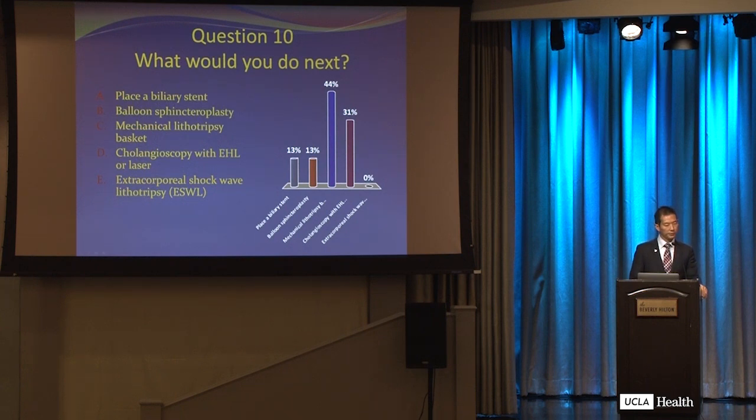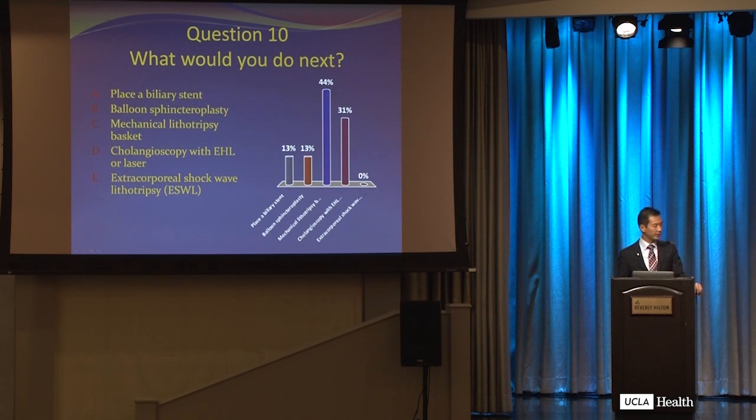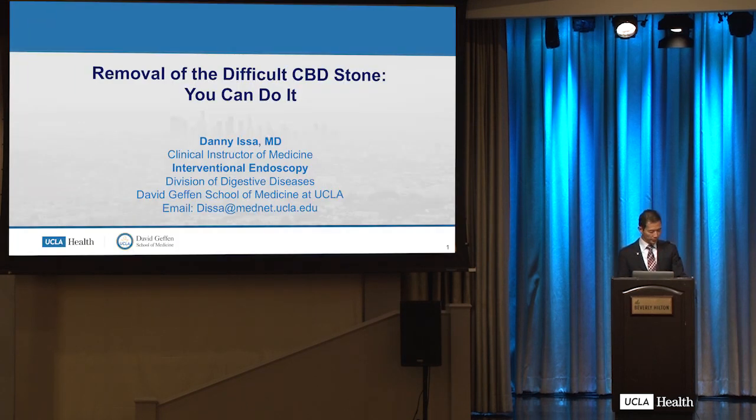All right, so most will do mechanical lithotripsy with a basket or cholangioscopy with EHL or laser. So to talk more about this, we have Dr. Danny Issa. We talk about removal of the difficult CBD stone. You can do it.